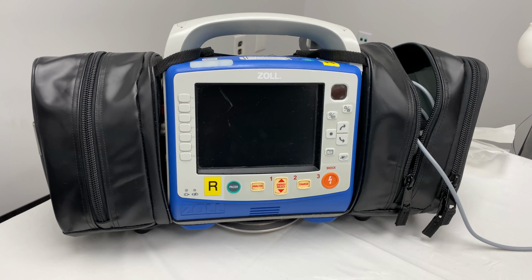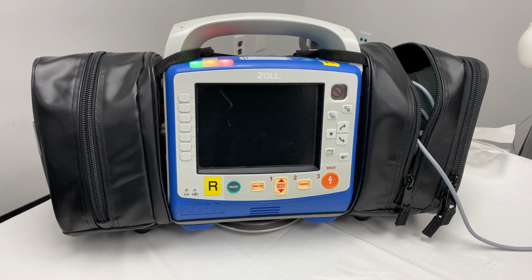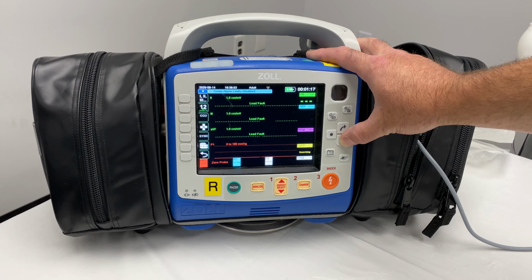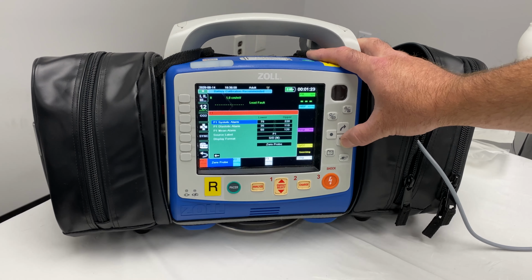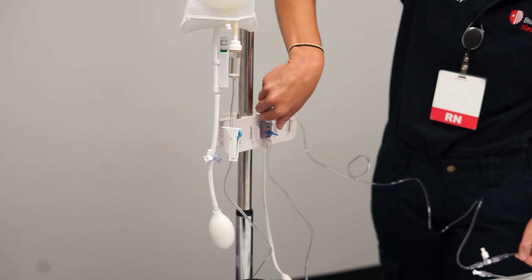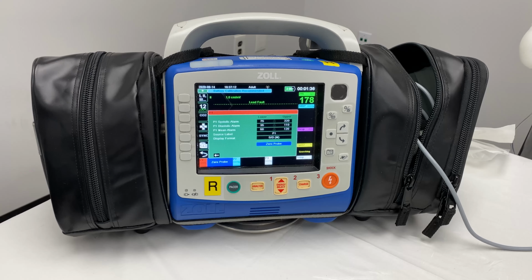Okay, so to zero the A-line probe to atmospheric pressure, first we're going to turn the monitor on. And we're going to scroll down to P1 after it's done with the self-test. And that will bring up the A-line menu, and we'll bring it to zero probe. At this point, we're ready to get the sensor ready. So we will turn it off to the patient, open to atmospheric pressure, give it a flush, and now we're ready to zero the probe.